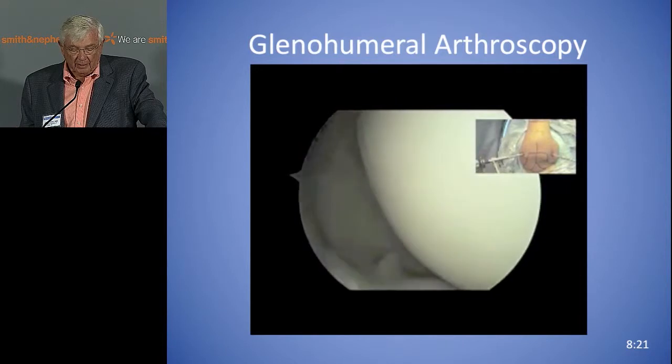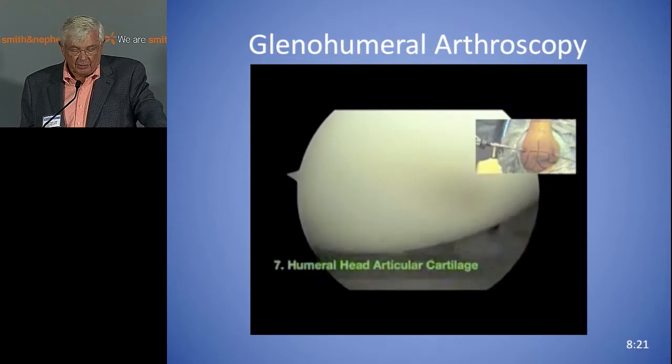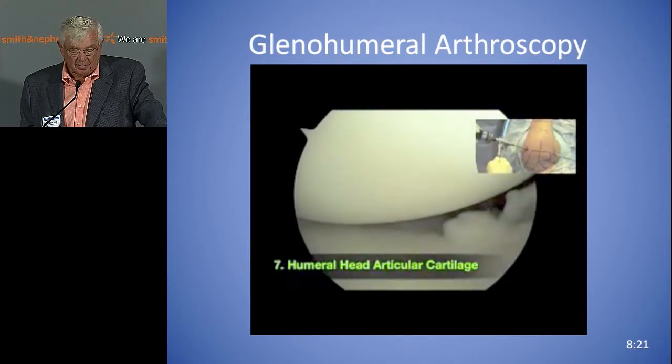Now we're coming down on the humeral head. Here we get a good look at the humeral head. And if you have an engaging Hill-Sachs, you can move it about to see what that looks like in this area.